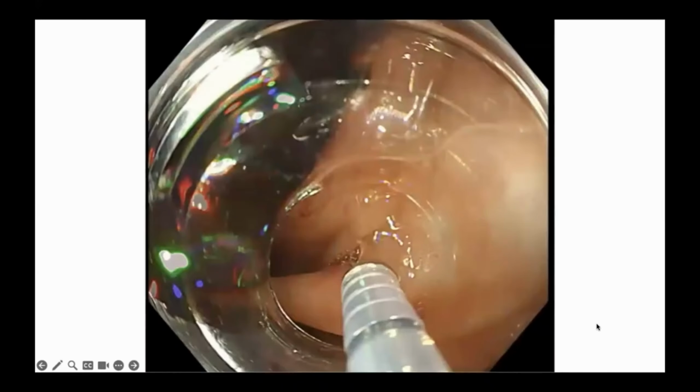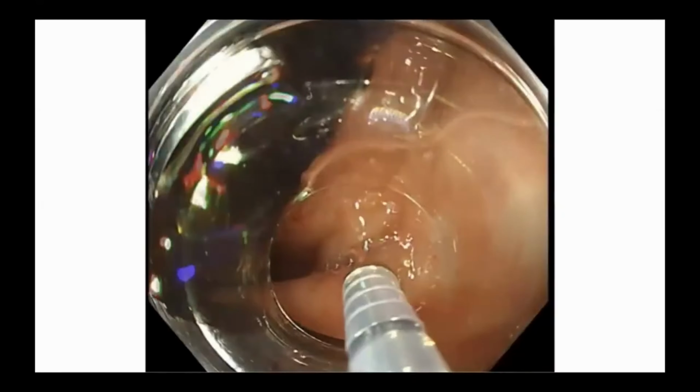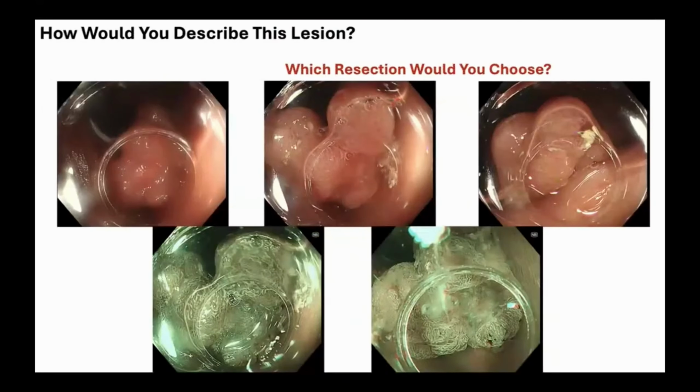In theory, because of the initial picture, you would have thought that this was going to be a much riskier lesion regarding deep submucosal invasion. I'll give you another example.